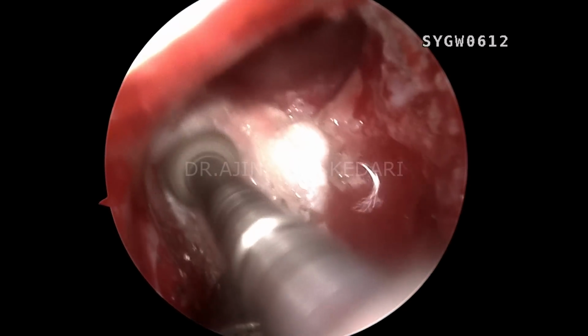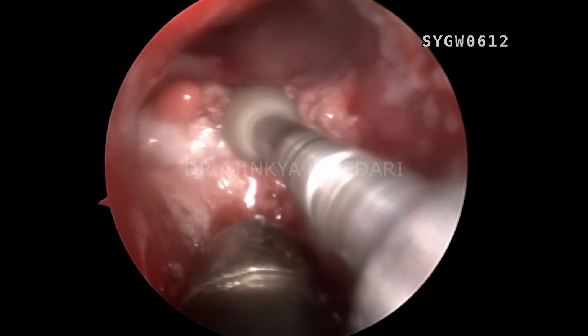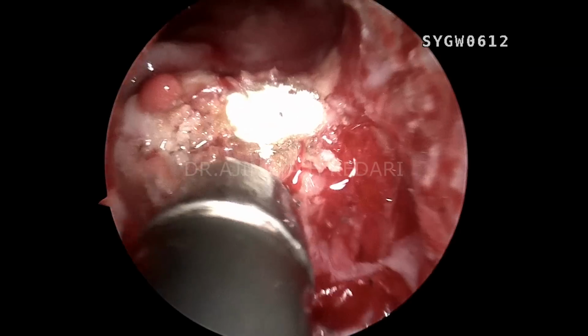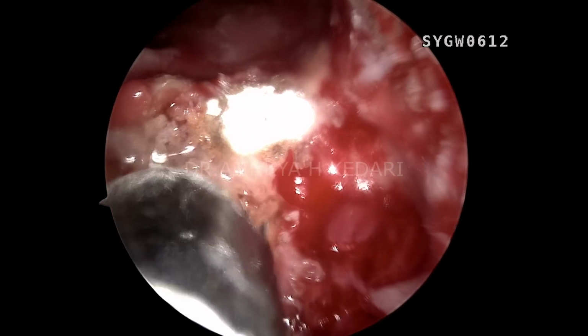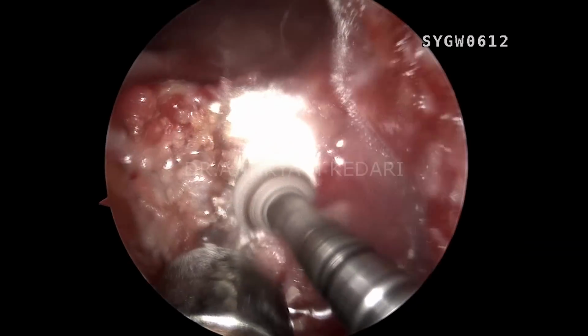So you can see careful dissection, careful drilling. You can see the endoscope is stable. The drilling is also stable. You can see there's a defect down there as well. You can actually see the arachnoid as well, a thin whitish membrane.